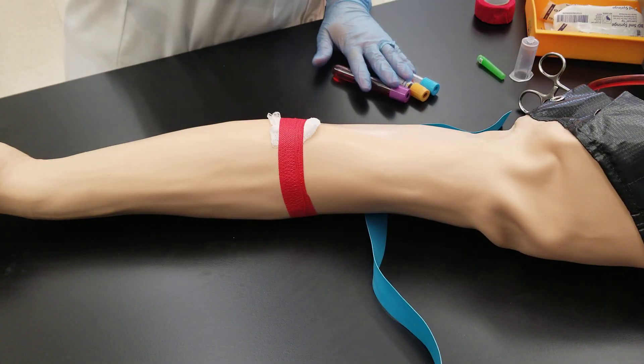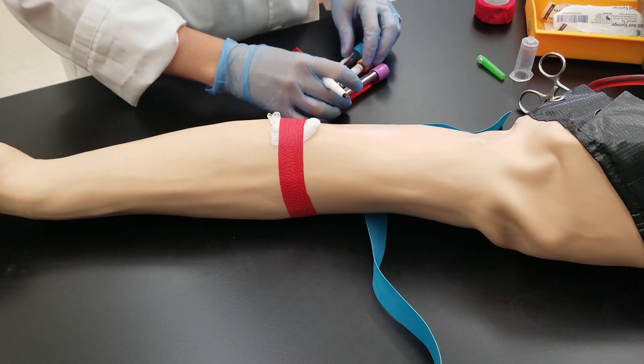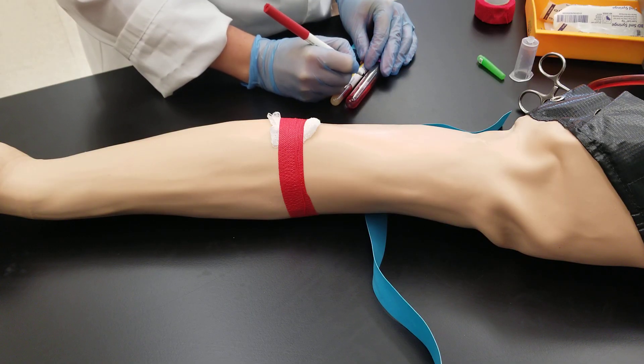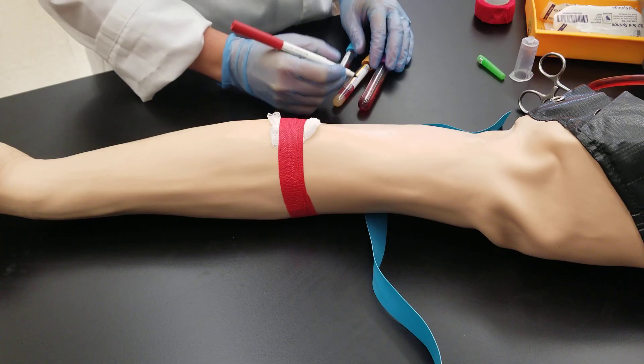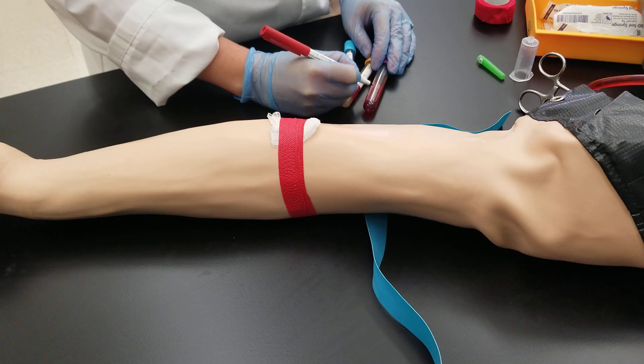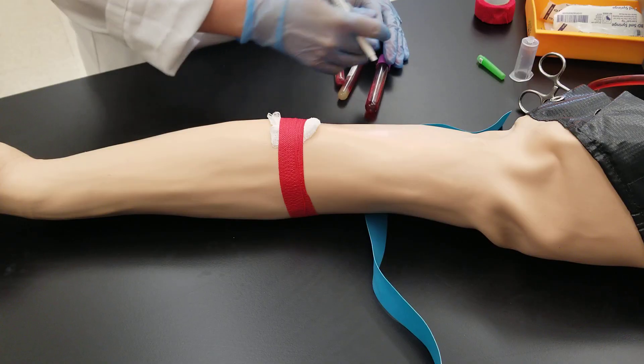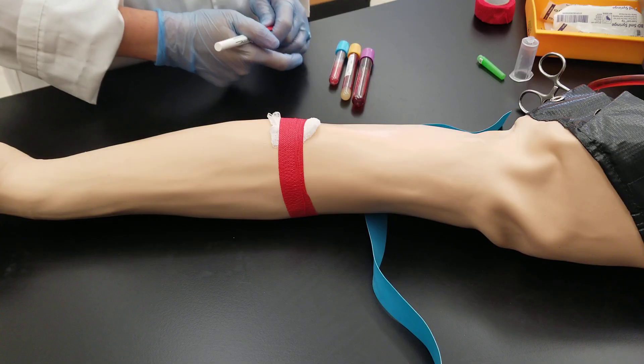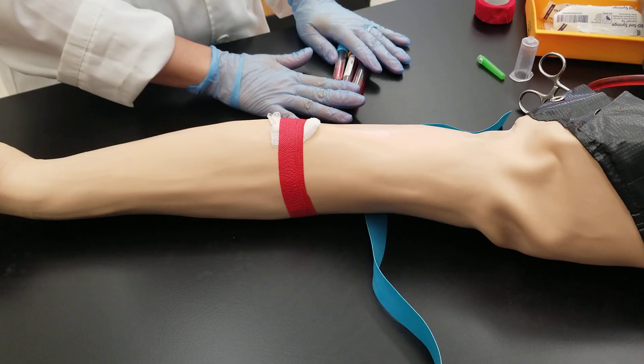And then I will label. If you have an automatic label from the system, then you can just put the stickers on here. So I'm putting the patient's information, my name and the date and time. And I will do that on all of these. You always label at the bedside to make sure that you don't have any possible clerical error and error of identity.